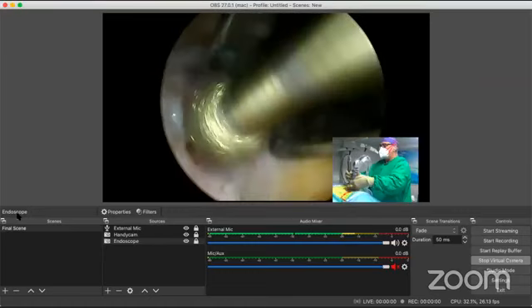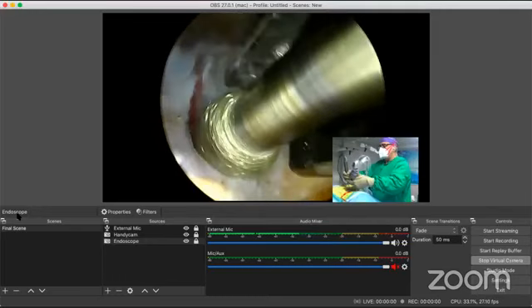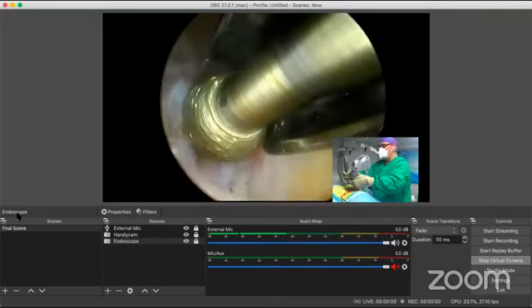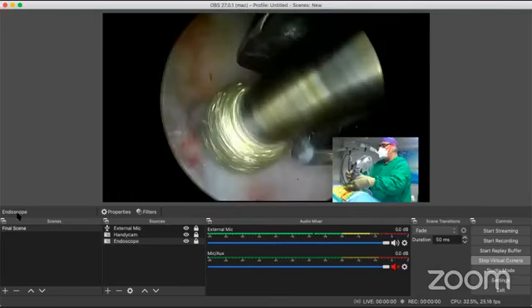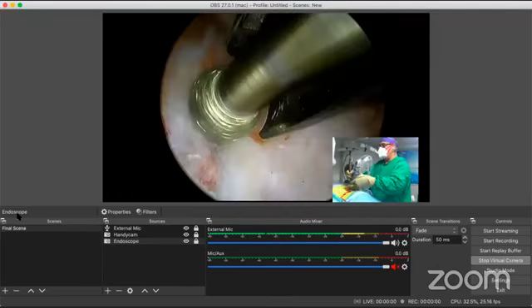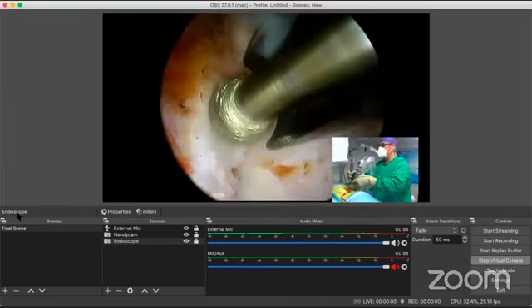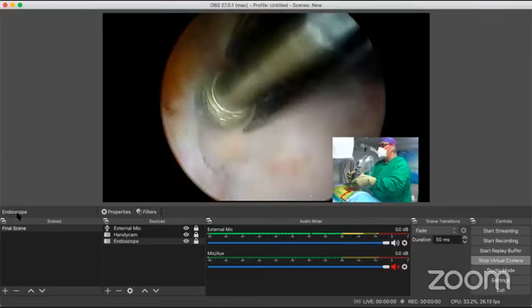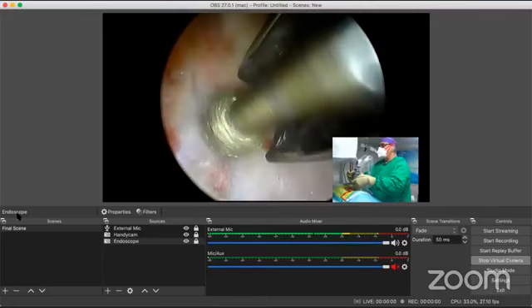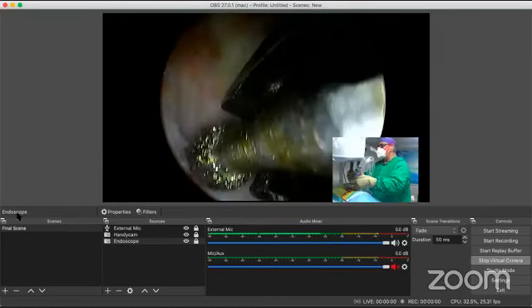Bring the C arm again now. I'm burring away the facet joint and I'm going upwards towards the lamina. Okay, towards the superior lamina, towards the superior laminar edge. Okay, guys. But one has to be very gentle because it's very thin here and the dura can easily open up. Stop 1 second. Okay, now 1 minute.